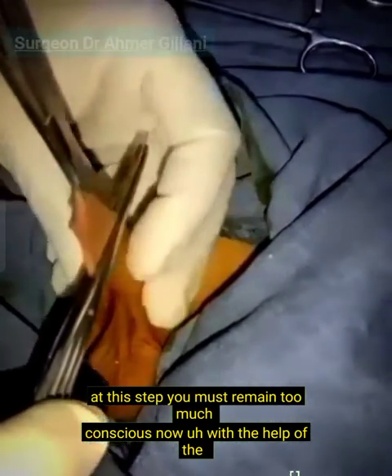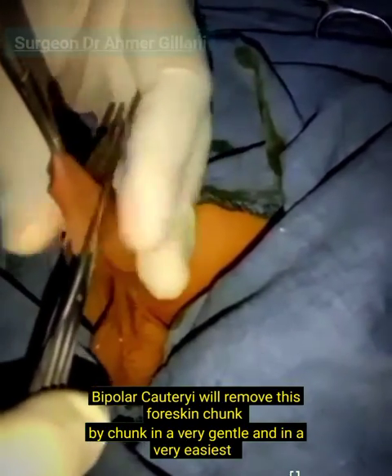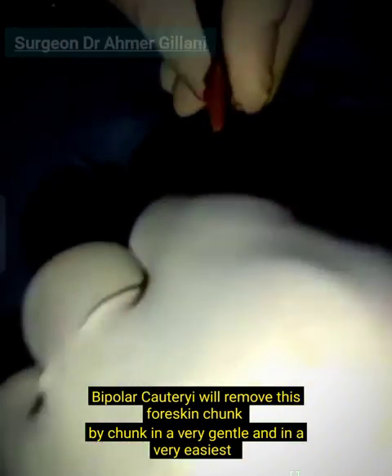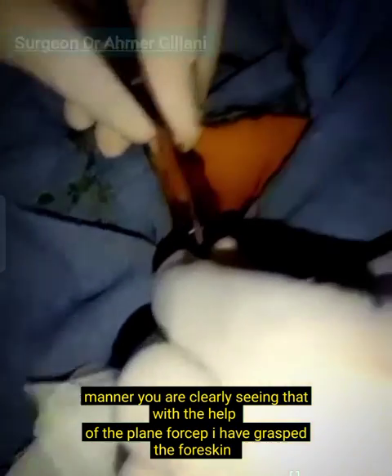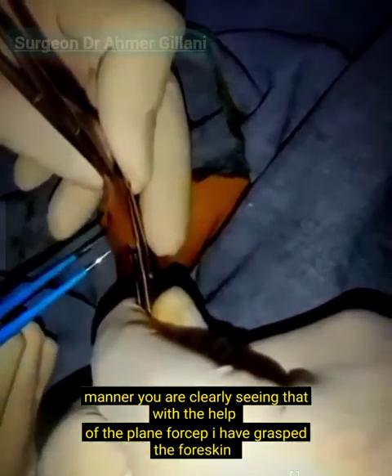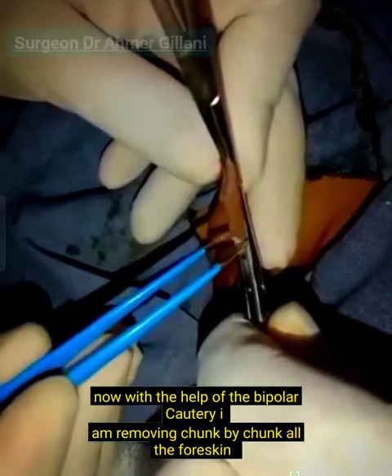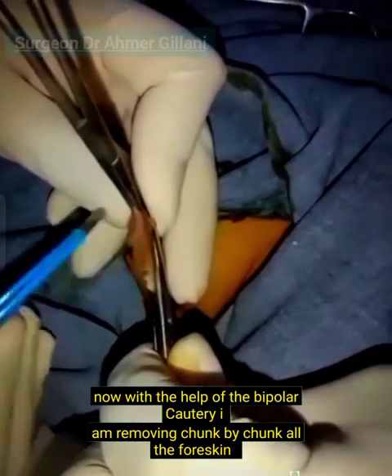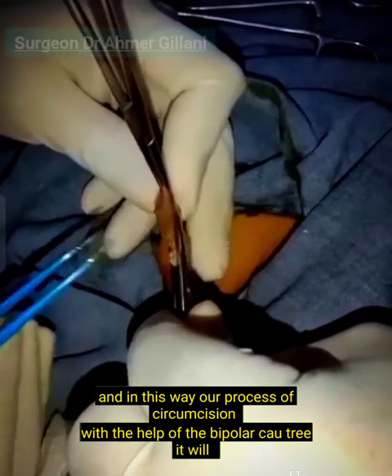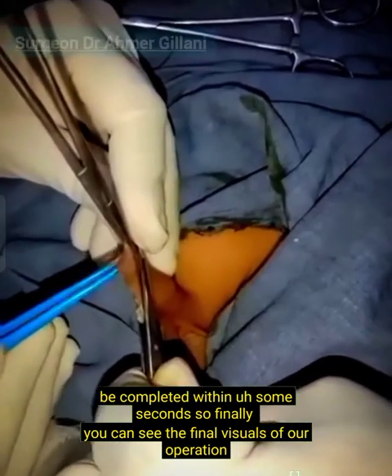Now with the help of the bipolar cautery I will remove the foreskin chunk by chunk in a very gentle and easy manner. You can clearly see that with the plain forcep I have grasped the foreskin, and with the bipolar cautery I am removing it chunk by chunk. In this way the circumcision process will be completed within seconds.